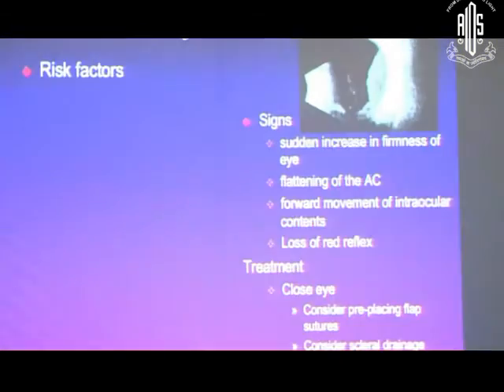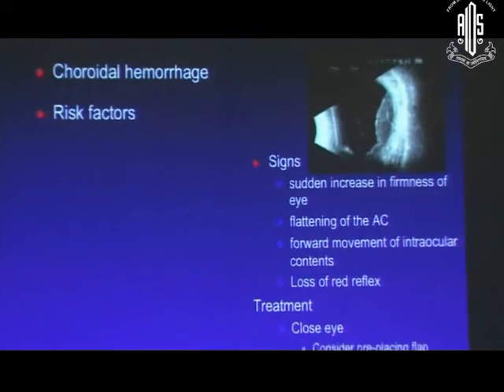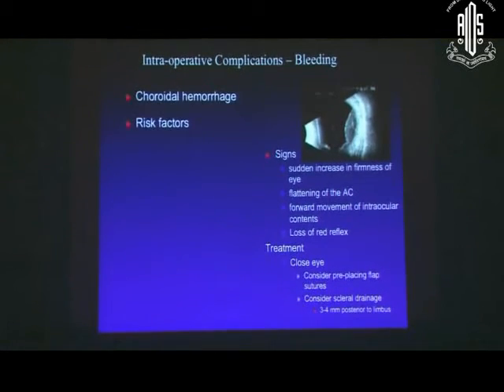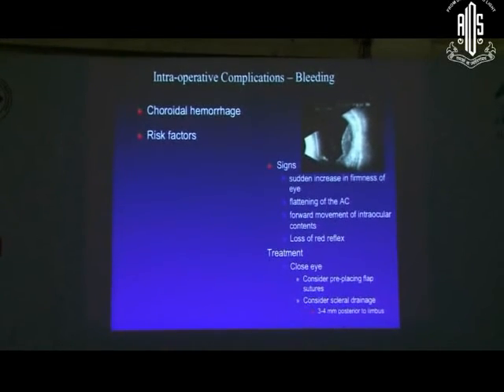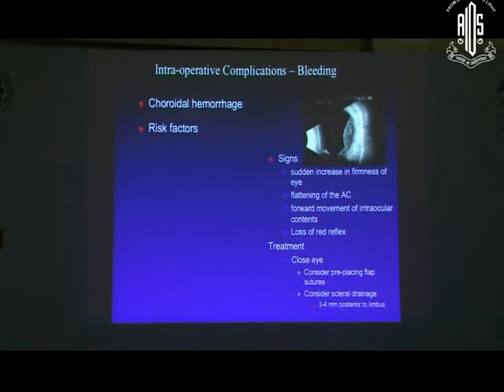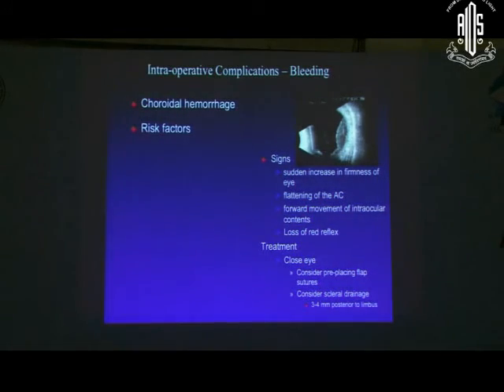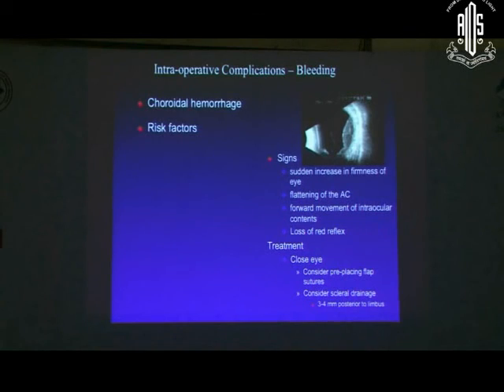A lot of times you have intraoperative bleeding. So the choroidal hemorrhage can happen, and you feel the eye suddenly goes tight. There is a sudden increase in the firmness of the eye, the chambers get shallow, and there is forward movement of the intraocular contents, and you suddenly notice under the microscope there is loss of the red reflex. Now these are the warning signs that there is something coming up. There is the choroidal hemorrhage which is coming up. So Dr. Ankur, if unfortunately it happens, you're doing a surgery, high pressures, and then suddenly you see the loss of red reflex, how would you address this situation?